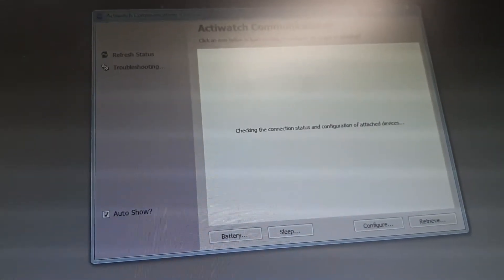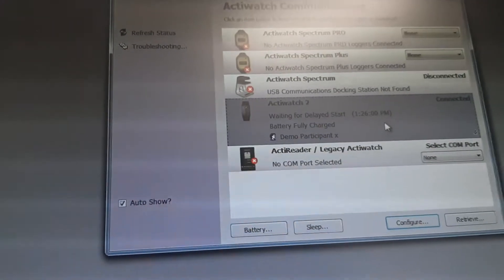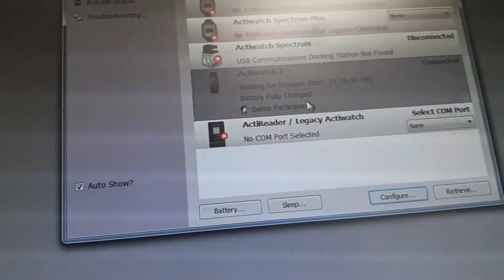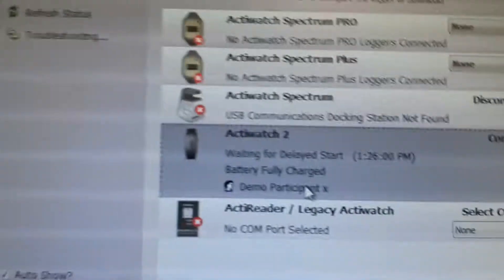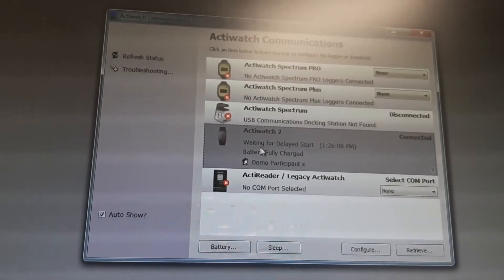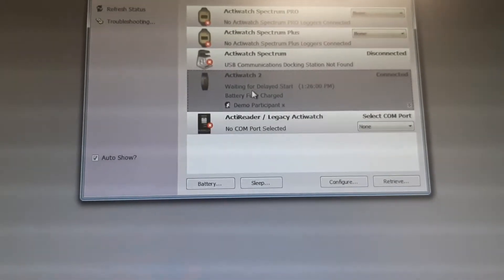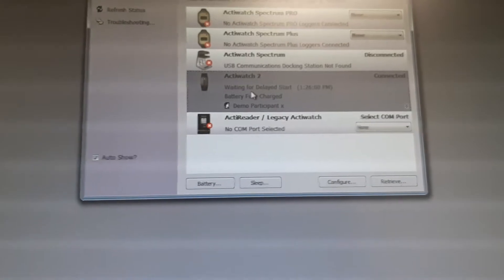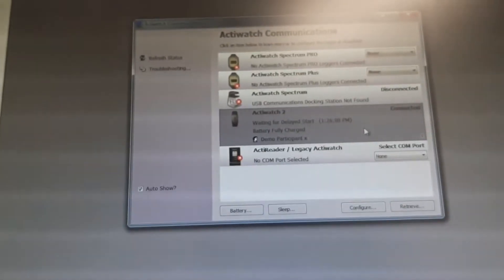Now I can close it, but I have to wait a moment because it will start collecting data at 1:25. It is currently 1:24, so when the time reaches 1:25 the status will change. Let's wait for it — battery is fully charged. Let's wait and see what happens.